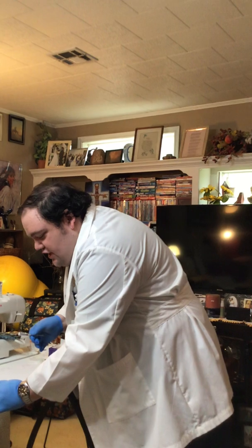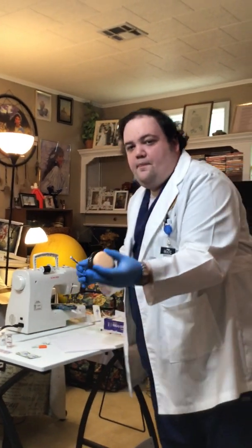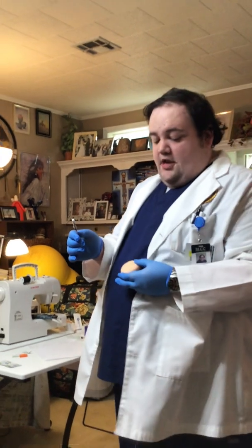We're going to make sure the bevel of the needle is facing upward. We're going to bunch up the fat like so. Can you see my hand? Yes. Okay.